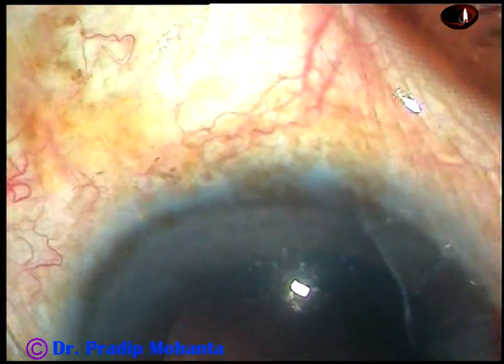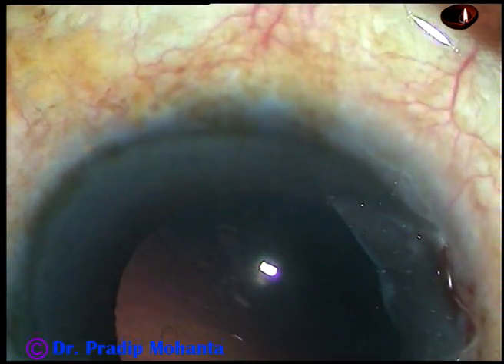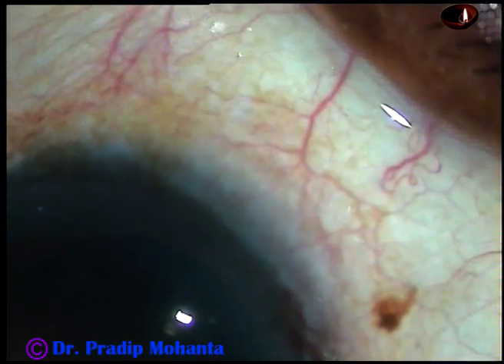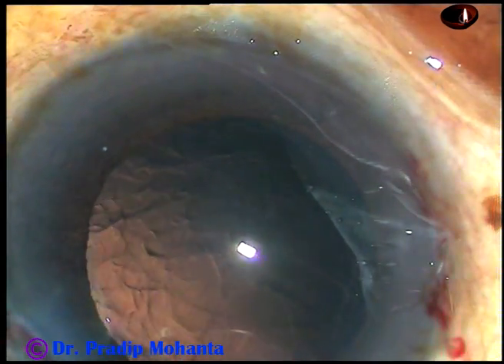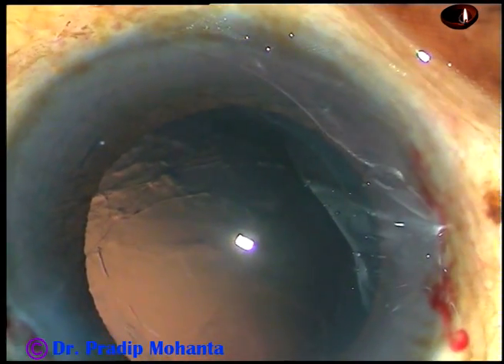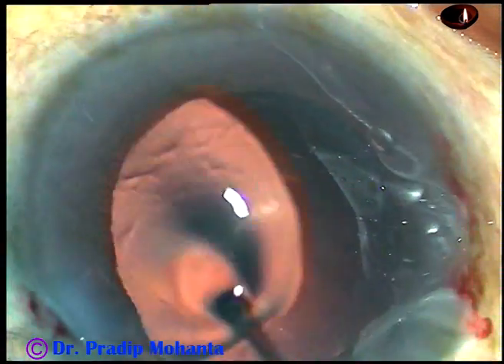And in this case, there is hardly any cortex left. So, in this way, you can manage a soft nucleus which is very difficult to hold and chop. You can just tilt it and manage it in this way.